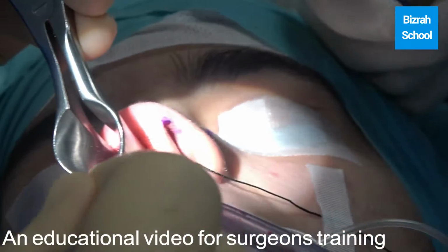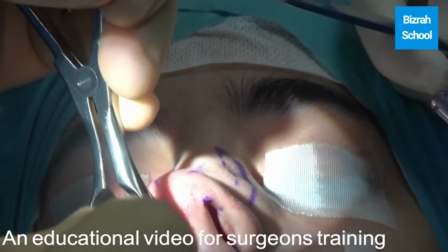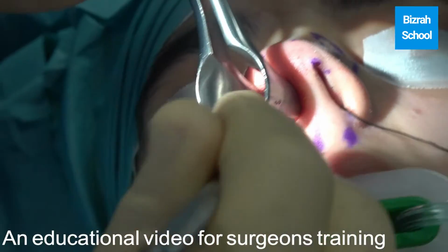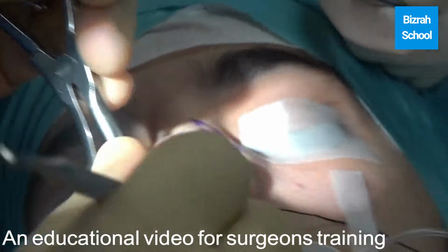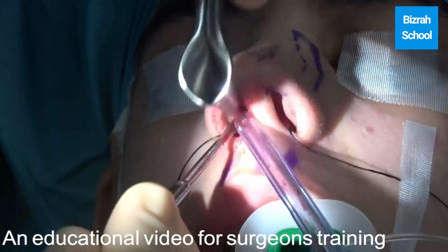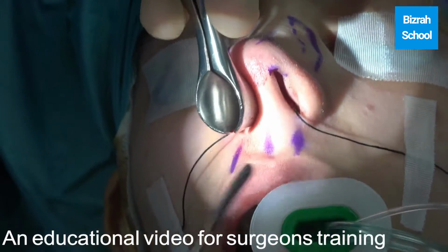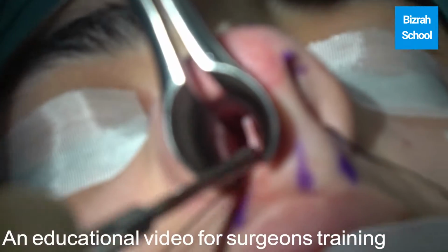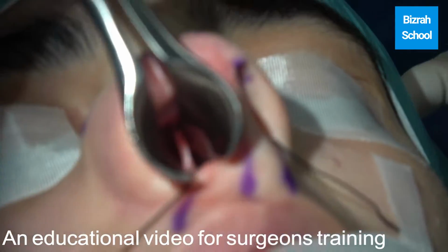You need to get to the right plane first. Now we are on the right plane. Start elevating the right perichondrial flap. When you are on the right plane, everything goes quickly and smoothly with not much bleeding. And you see now the cartilage in the middle.